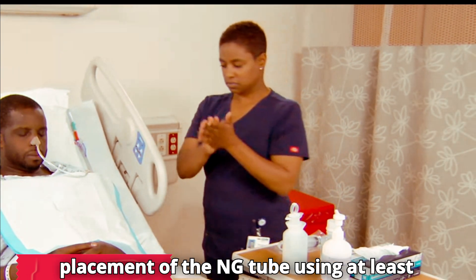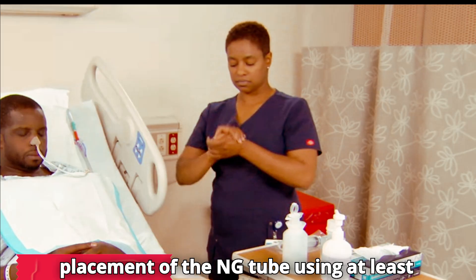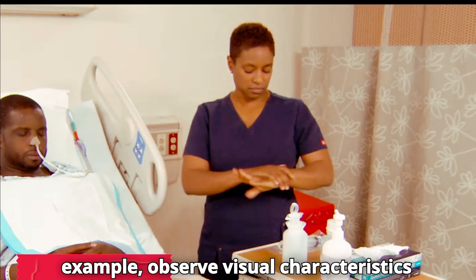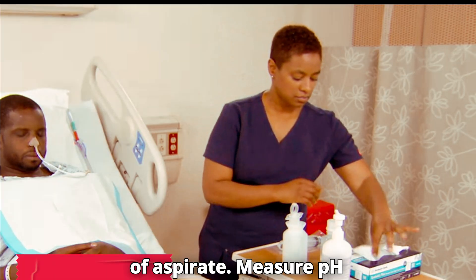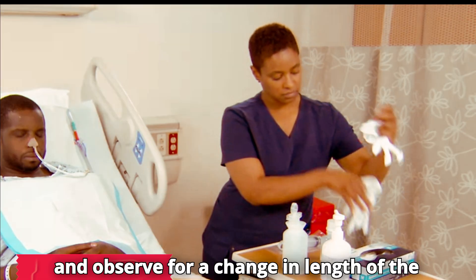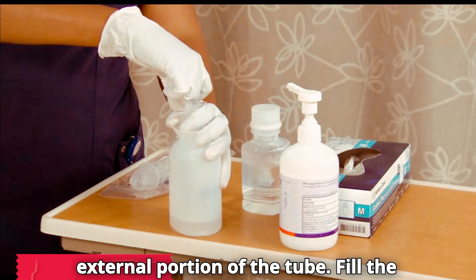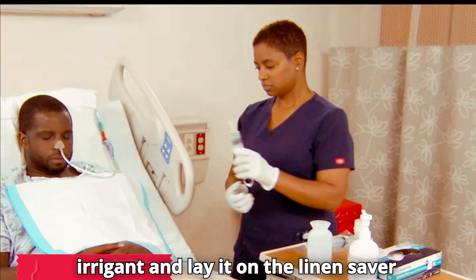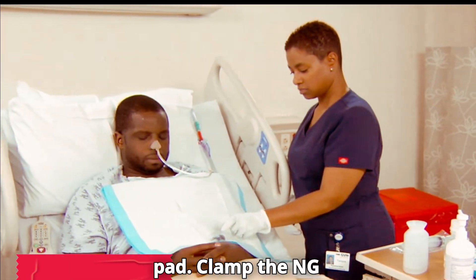Check for correct placement of the NG tube using at least two bedside methods. For example, observe visual characteristics of aspirate, measure pH, and observe for a change in length of the external portion of the tube. Fill the syringe with 10 to 20 milliliters of irrigant and lay it on the linen saver pad.